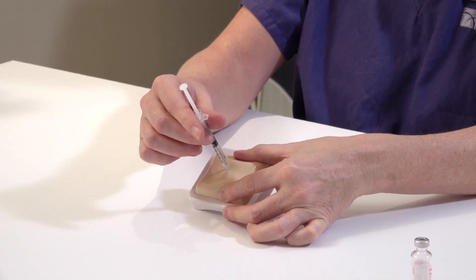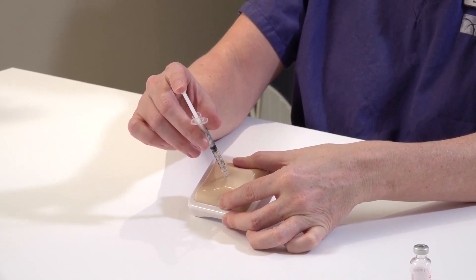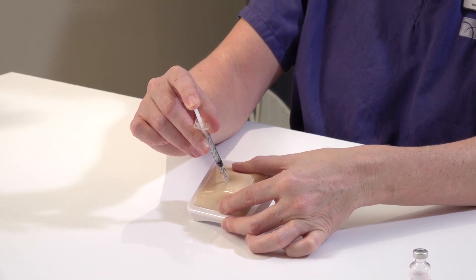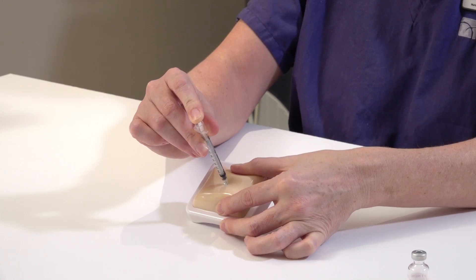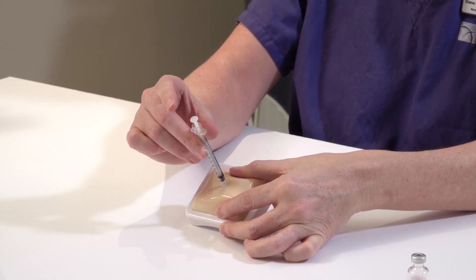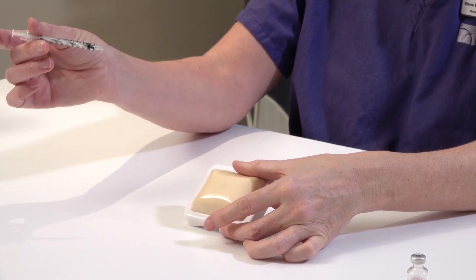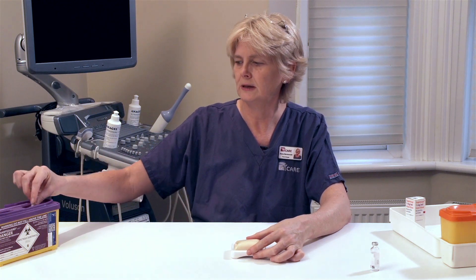The needle should go all the way in up to the hub. Depress the plunger so that the fluid enters into the skin. Wait for a few seconds and then remove the needle from the skin and release your grip. Dispose of your needle into your sharps container.